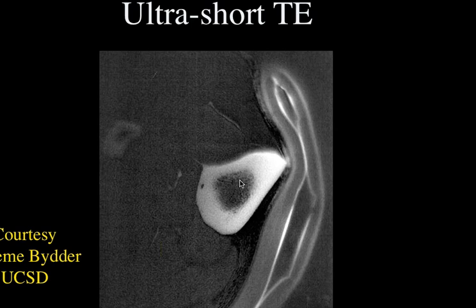and we'll talk about those later. But there are two basic different coils. One is a send-receive coil, and one is just a receive coil. In this particular case, they use the body coil to send the signal, and they receive the signal from the coil that you see there. So this was a receive-only coil. That works out well for a lot of things. You can get very uniform signal if you use the body coil. It's usually a very good coil to use for the transmit signal. The problem at high field, if you do that, is then you expose the whole body to RF.